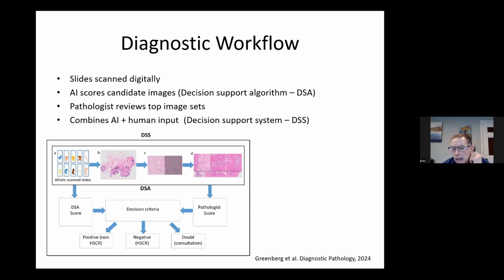So I think that's another benefit here, eliminating the potential latency of dependency on the pathologist to read multiple different tissue samples.